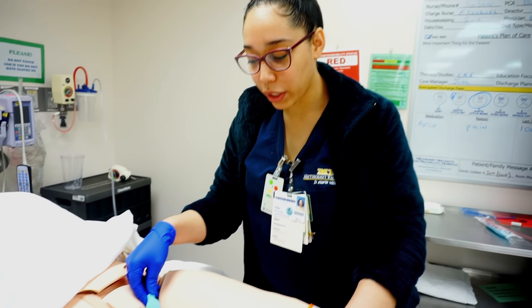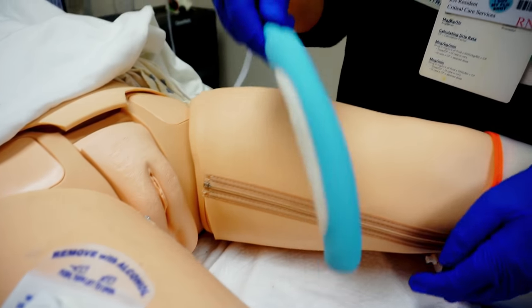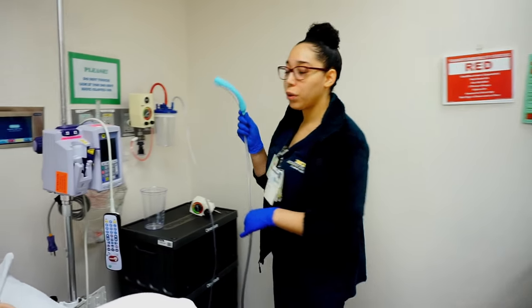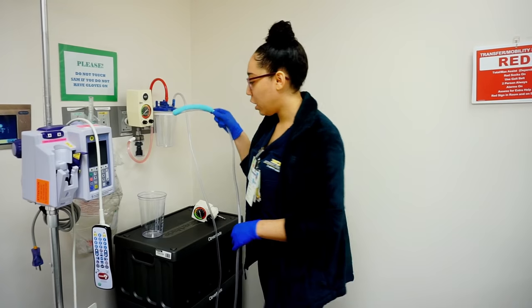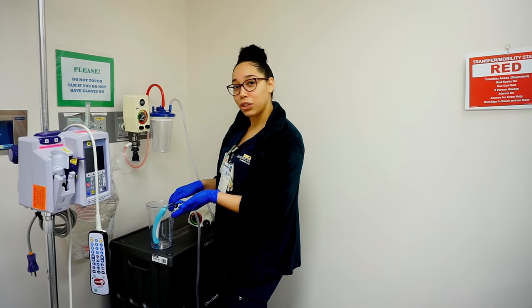To remove the Purewick, open up the patient's legs and gently remove it. Keep the suction on while you're removing it. You can either dispose of it in the trash, or if the patient is getting up with physical therapy or occupational therapy, you can store it in a canister with the suction still on — it will still be good to use.